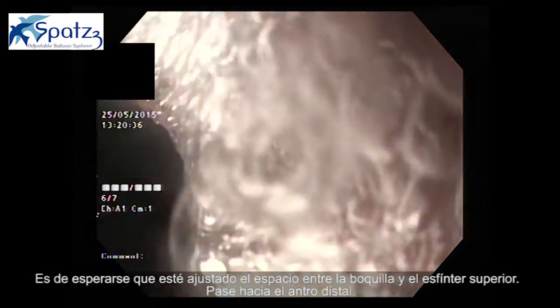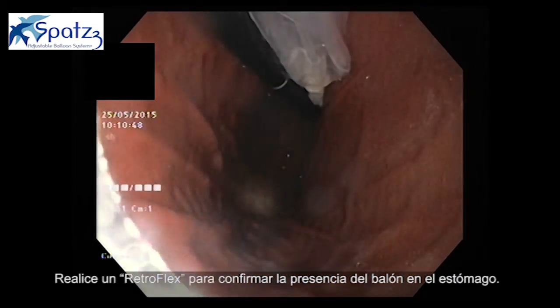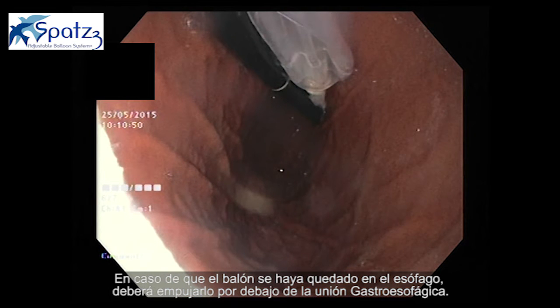Pass to the distal antrum. Retroflex to confirm presence of the balloon in the stomach. If the balloon fell off in the esophagus, you will need to push it down below the GE junction.